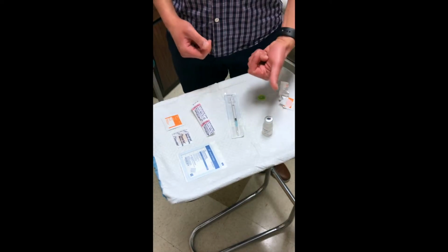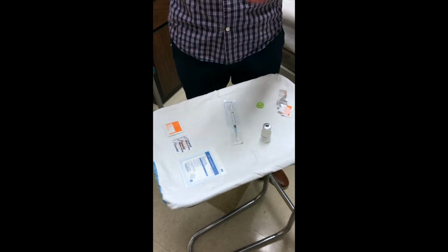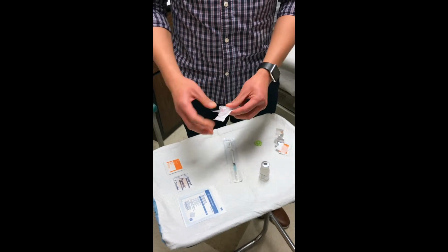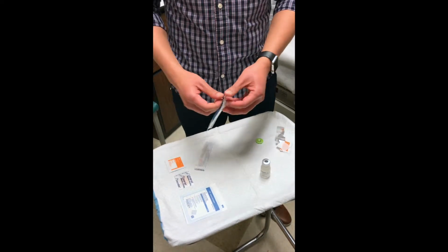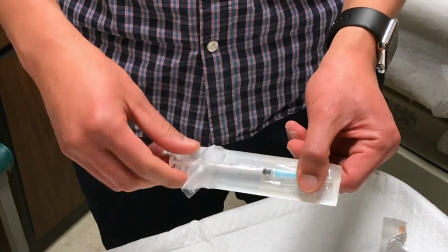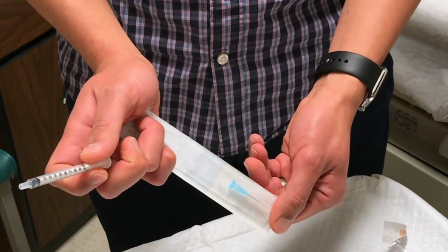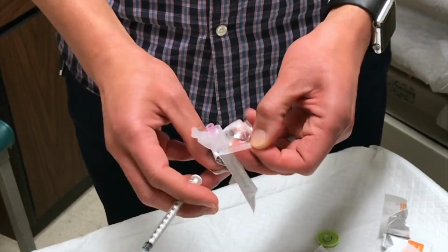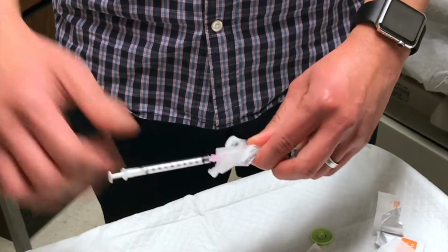All right, so now that our rubber stopper is dry, we can start preparing. We can start off by peeling open your 18 gauge needle, keeping it in the plastic to make sure that it stays clean, and then peeling open your syringe. For here, we really only need the syringe. So you can twist to the left to loosen the syringe and take it out, and I like to leave the needle in the plastic, that way it stays clean. I connect the 18 gauge needle to my syringe. Righty-tighty, you hear the squeaky noise, that means you're set.